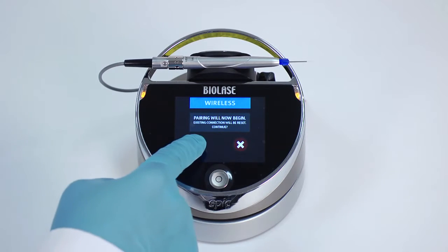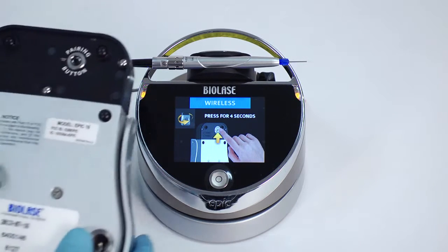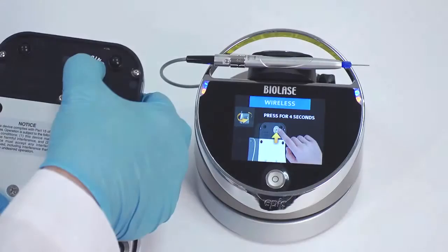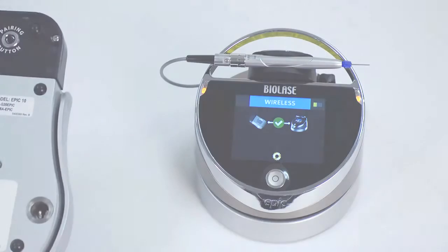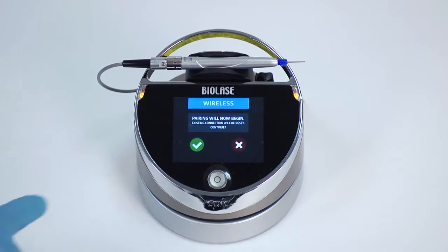A message that pairing will now begin will appear. Press the green check mark to continue. To complete the pairing process, turn the foot switch over and press the pairing button for 4 seconds, then release. After 2 to 3 seconds, a message should appear indicating that pairing was successful. If pairing is not successful, a screen will appear with a red X between the EPIC and foot switch. Press the Try Again button.